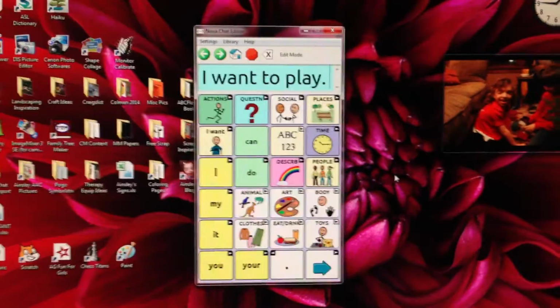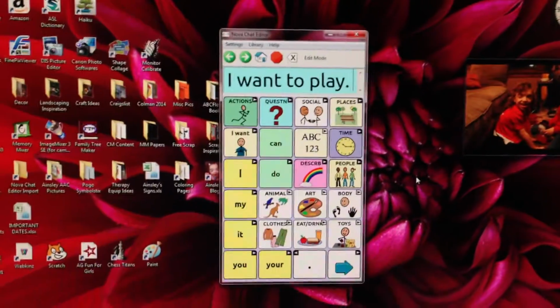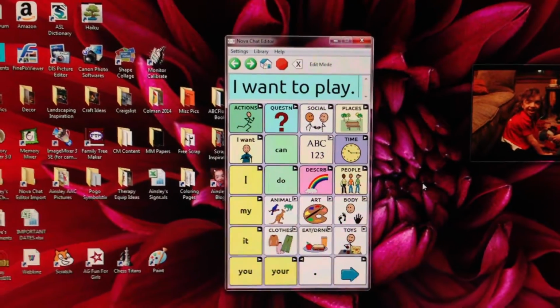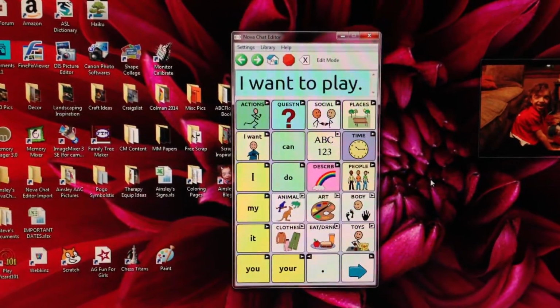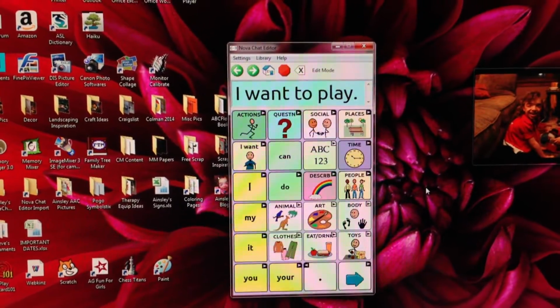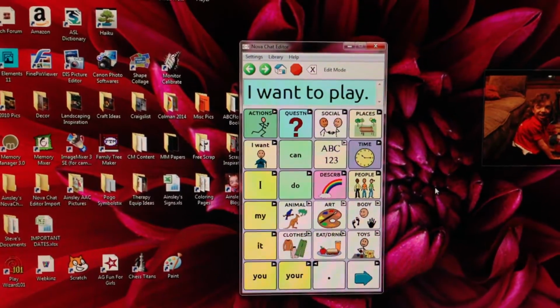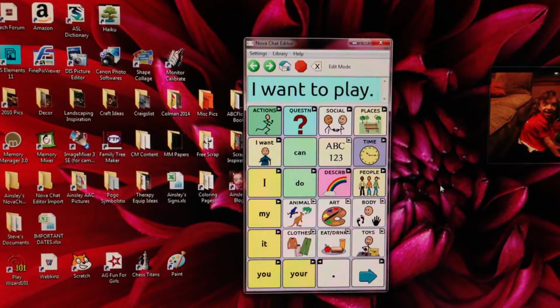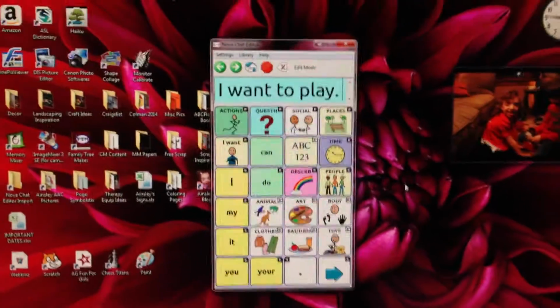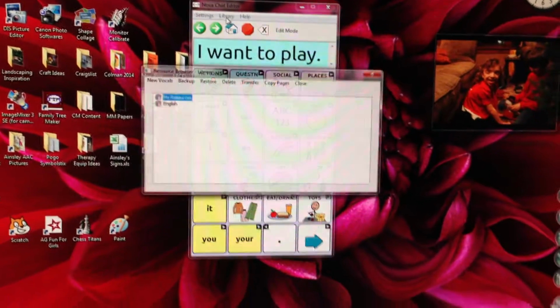And although it sounds easy to add symbols to the pages, the reality is that these vocabularies are quite complex, and they have hundreds of pages. So it's not a small undertaking to add symbols to a vocabulary. But in some situations, that may be what you have to do. And unfortunately, we have found ourselves to be in that situation.